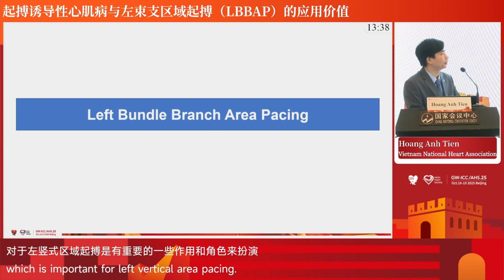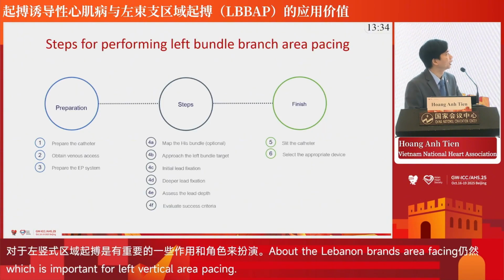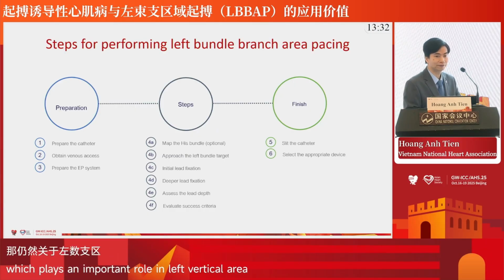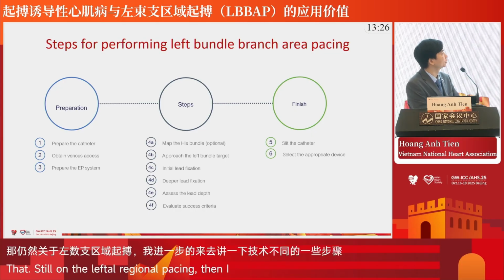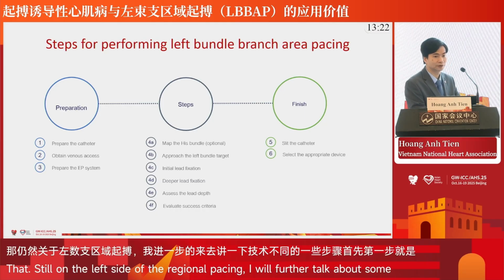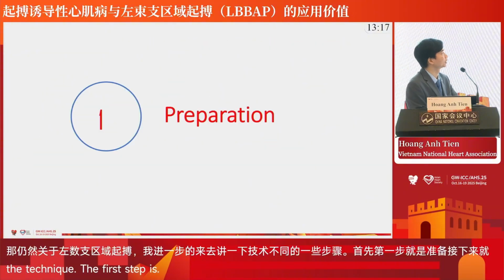About left bundle branch area pacing, I would like to concentrate on the steps of the technique. The first step is the preparation, the next is the technical step, and the third is the finishing step.